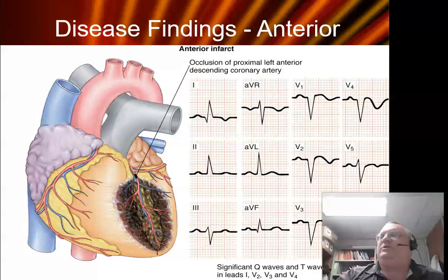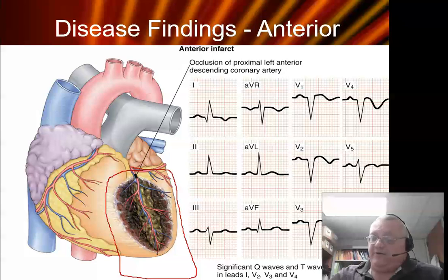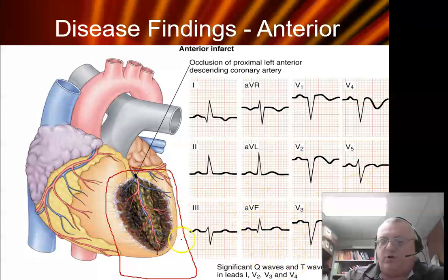The anterior wall of the heart, by the way, is usually your left anterior descending branch of your left coronary artery, okay? And I would probably remember that little factoid. That's kind of an important factoid. You might want to remember that one. So what does that mean exactly? That means that this part of the heart is actually dying, the anterior wall.